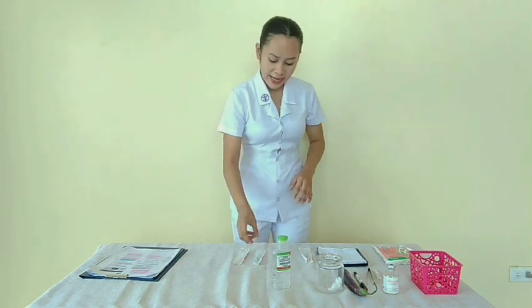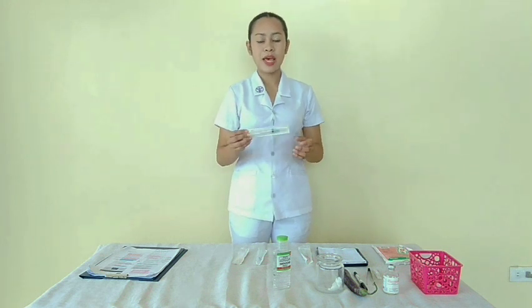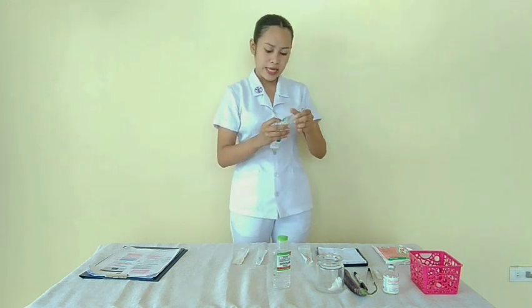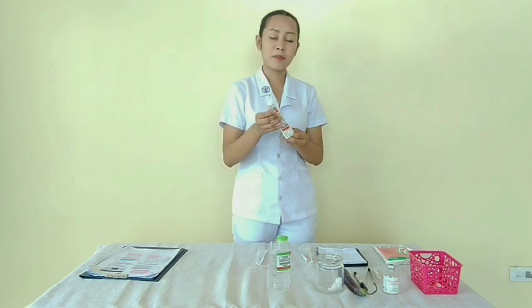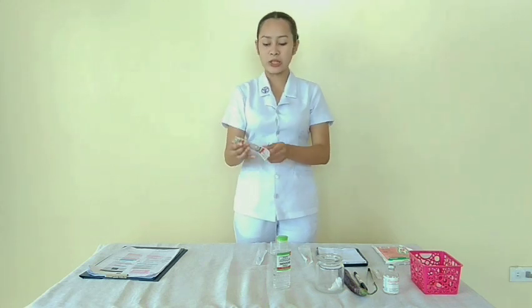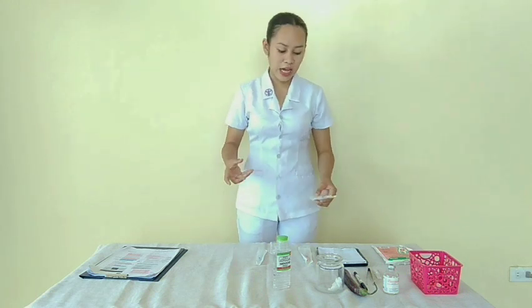I'm going to proceed to the preparation of the medication in an ampoule, but first I'm going to prepare my syringe, and have here my 5cc syringe. And open the package. And since my syringe comes with the needle, I am going to loosen it first so I can connect it to the aspirating needle. Then connect it, and make sure that the connection isn't loose by rotating it. Then set it down first.